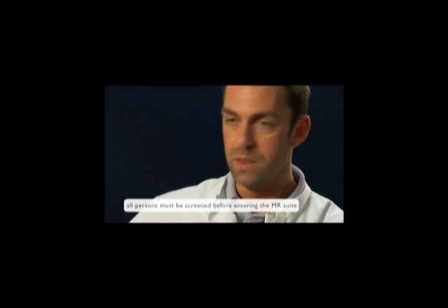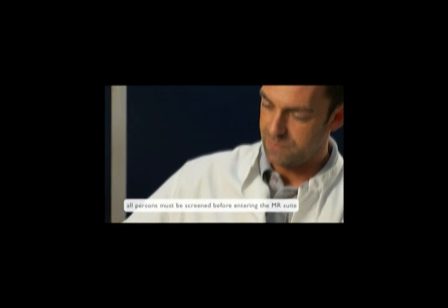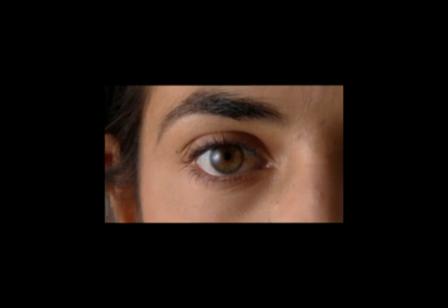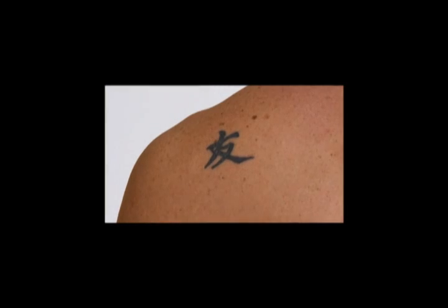Screen everyone for ferromagnetic objects in their bodies, such as implants, bullets, and shrapnel. And screen everyone for metal on or attached to their bodies, such as hairpins, brassieres, buttons, zippers, jewelry, and body piercings. Even makeup and tattoos can contain ferromagnetic material. Remove all makeup and be alert to the possibility of irritation in tattoos.